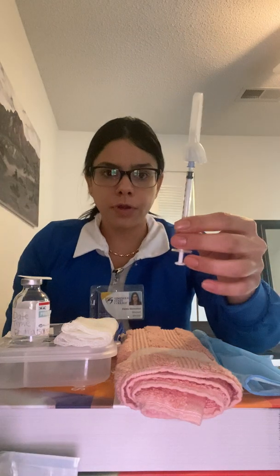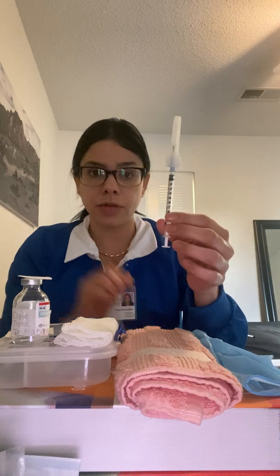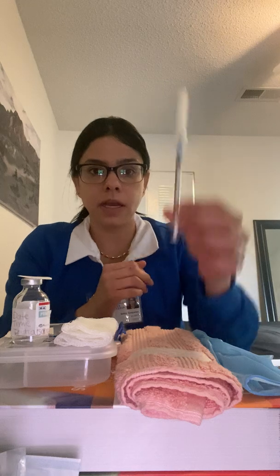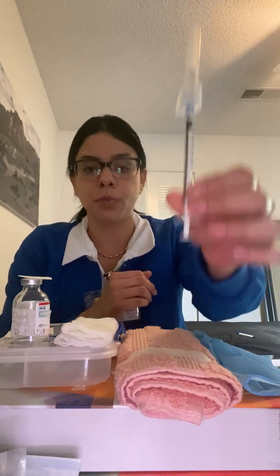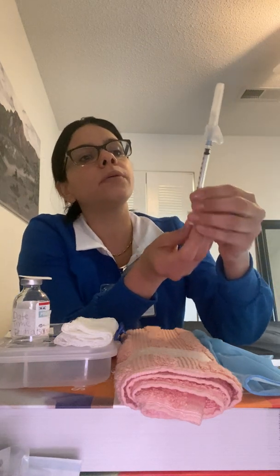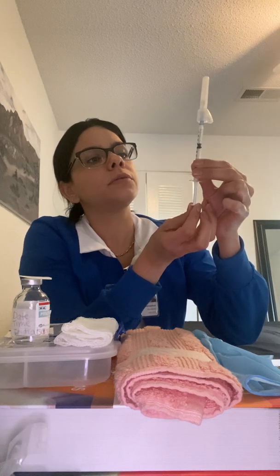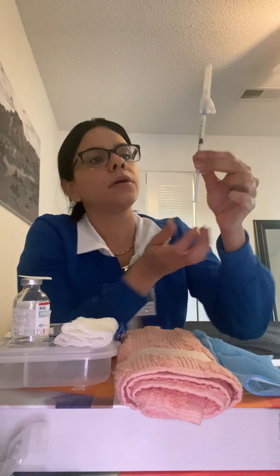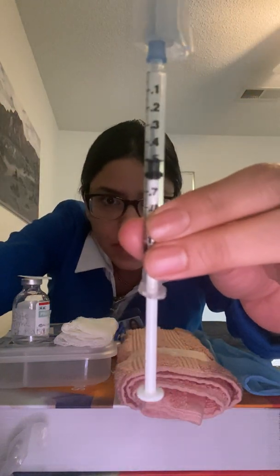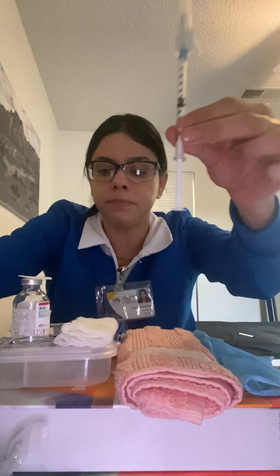So when we are doing a vial, I need to draw the same amount of air as the medication I need, meaning that I need 0.5 ml of medication, so I need to draw back first 0.5 ml of air. And that's what I'm going to do now, and I'm going to be showing you. I'm going to go down, down, down. All right, so if you can see it, it's 0.5 ml of air, okay?